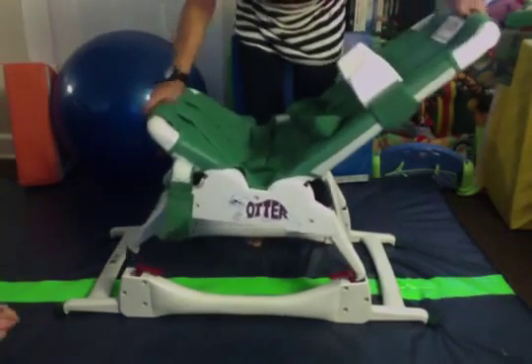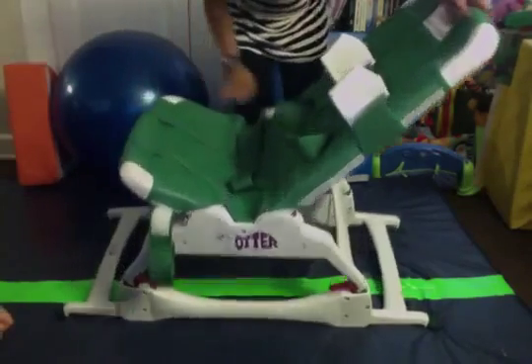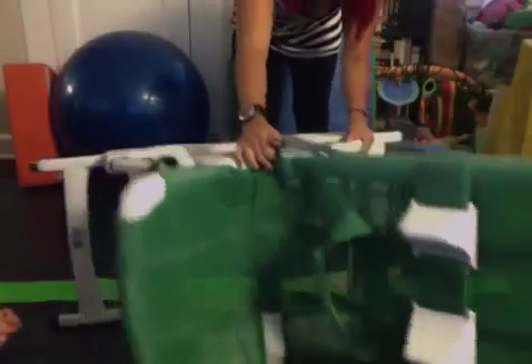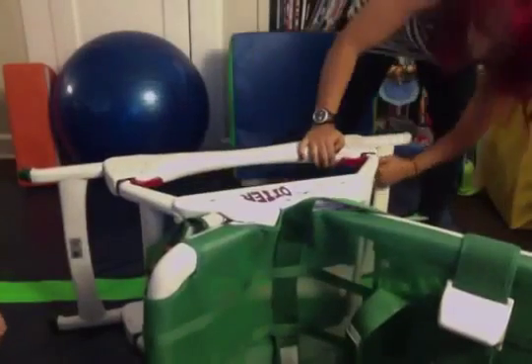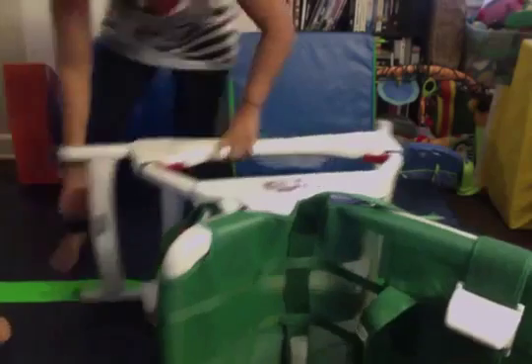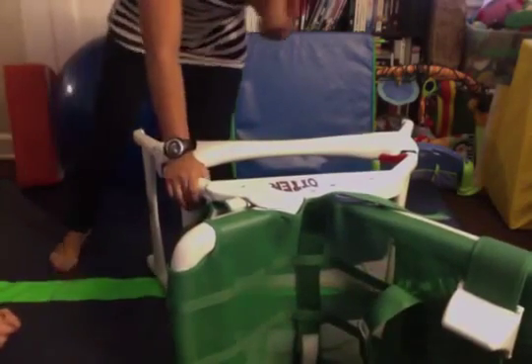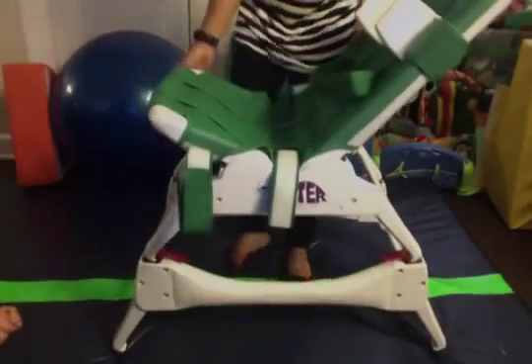Line up the legs of the chair with the stander and they go right there into those red holes and snap in. You can go this low, or switch it to where it's even higher. I like this mode because I don't have to bend over when I bathe him.